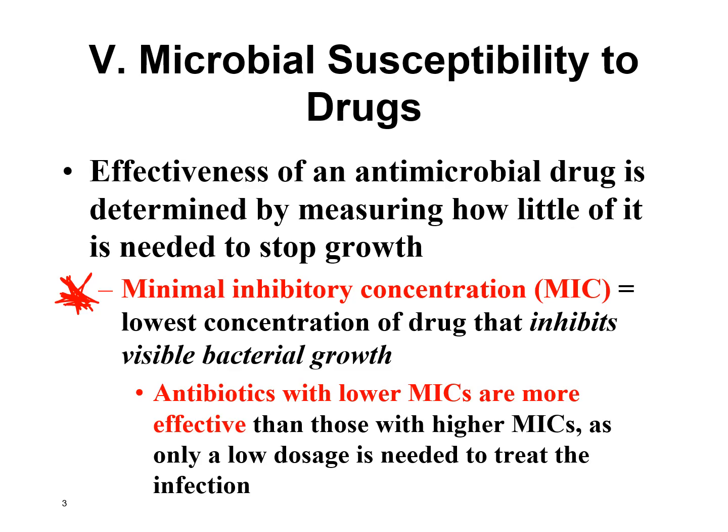The other important thing to remember is that the lower the MIC that an antibiotic has, the more effective that antibiotic is going to be. So it's going to work better, and you're also not going to have to use very much of the antibiotic in the patient, which means the lower the dose you use, the less of a chance you're going to have it causing side effects, which is good.